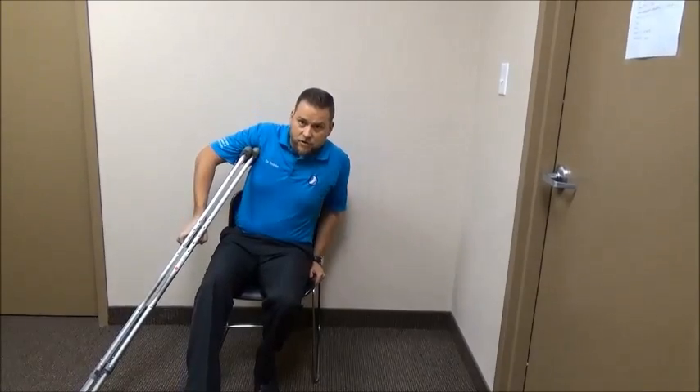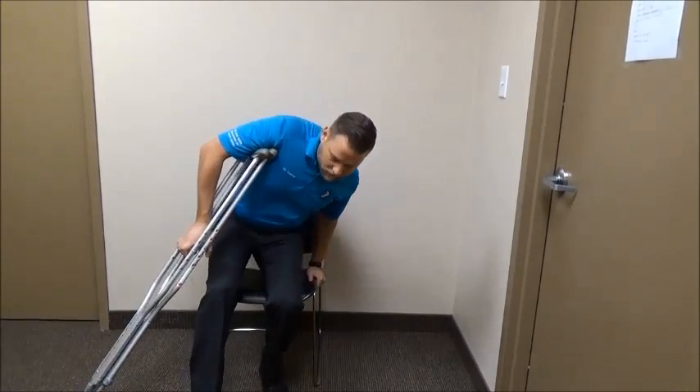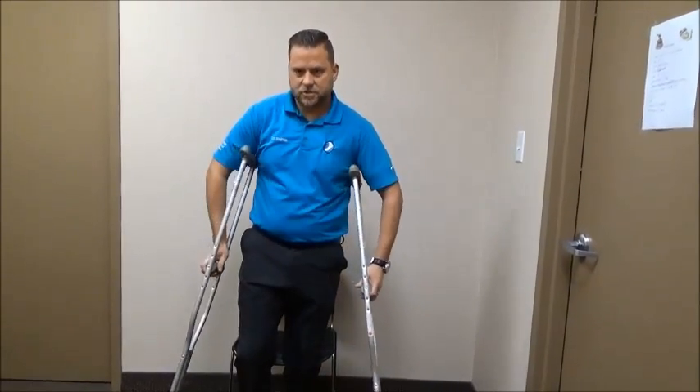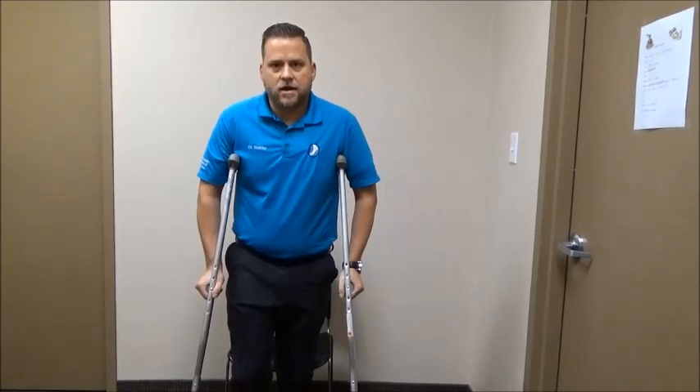When getting up, it's the same process in reverse. Both crutches go into the same hand on the injured side. Use the opposite hand to push yourself upward, then use the crutches to relieve pressure on the bad foot. When finished, pass the crutches back to both arms and continue on your way.